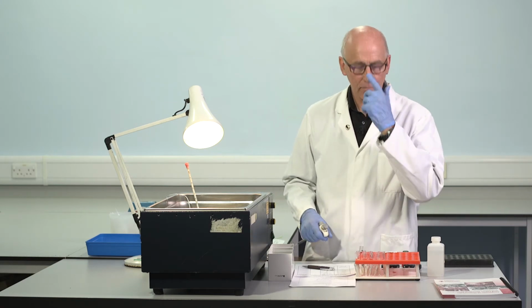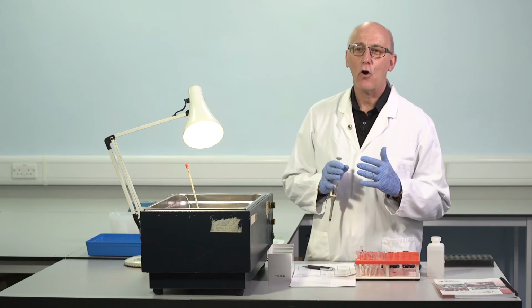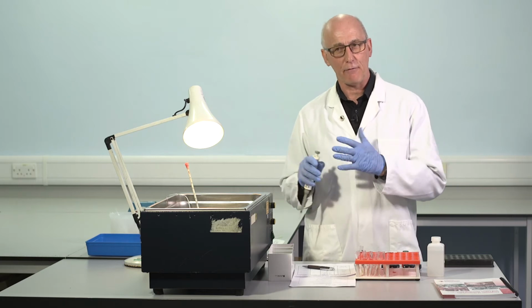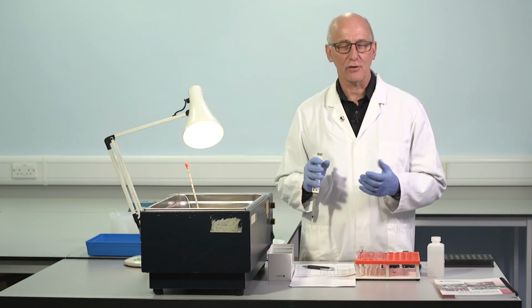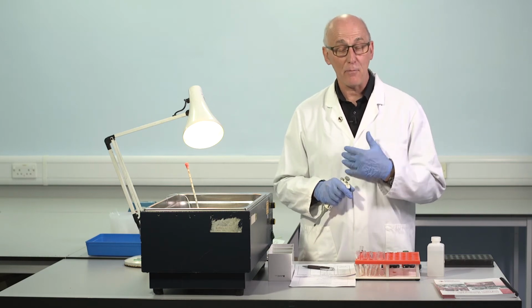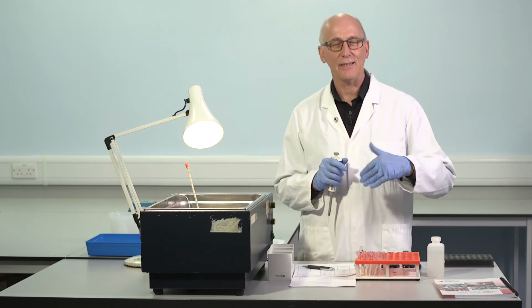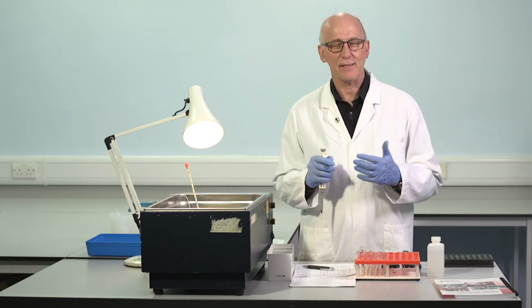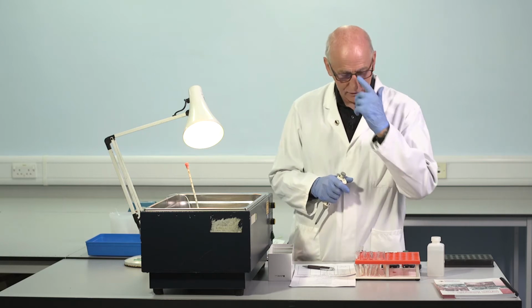Patient sample, 3 dilutions, really important. Every guideline which tackles factor VIII assays, WFH laboratory manual, CLSI guidelines, national guidelines, common theme, every guideline related to factor VIII that I'm aware of recommends testing patient samples at least 3 dilutions. I think 3 is perfectly adequate. I don't think anything is gained by testing 4 or 5. 3 is enough in my opinion, but important to test 3.